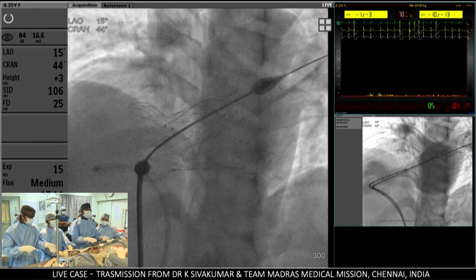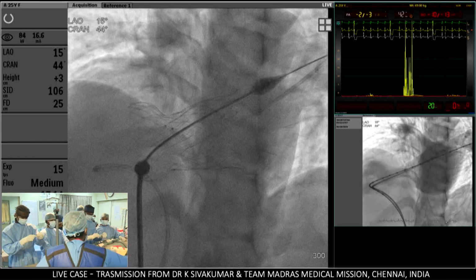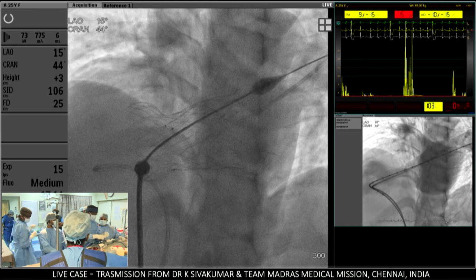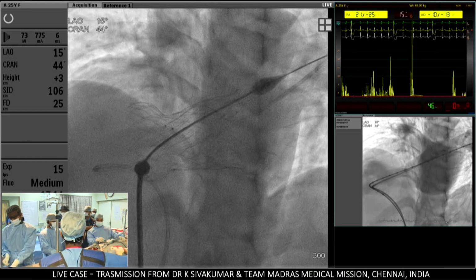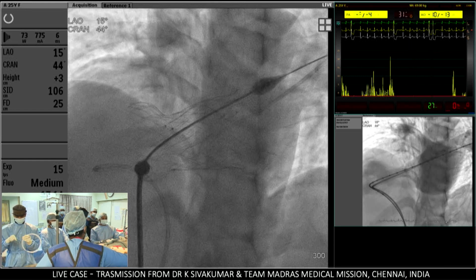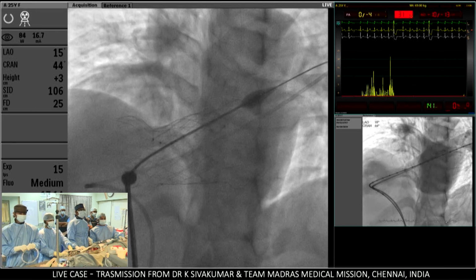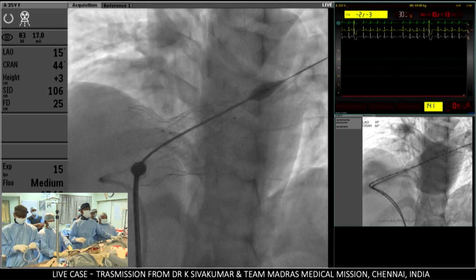Not being a venous operator, do you see any challenges removing the carrot through this valve with that angle, or should it be pretty simple? I wish it goes simple, Alison. There were times at which there were some difficulties faced. Let me try it out. Now, what I'm going to do now is make an angiogram of the distal part.